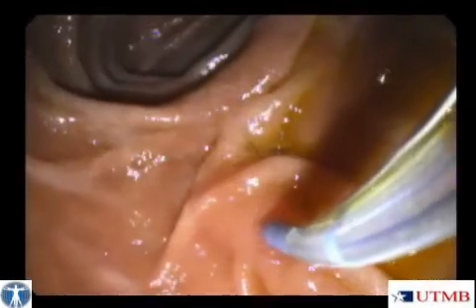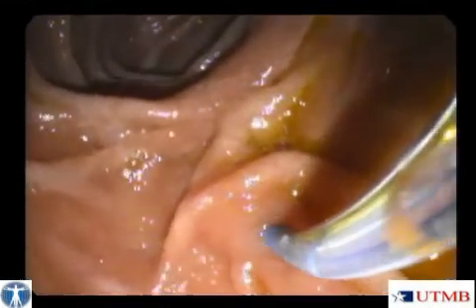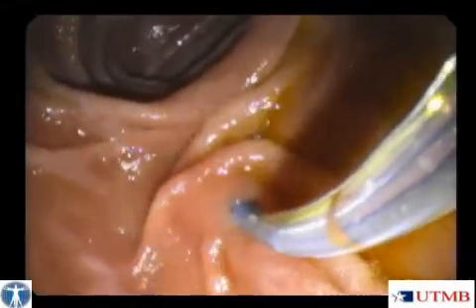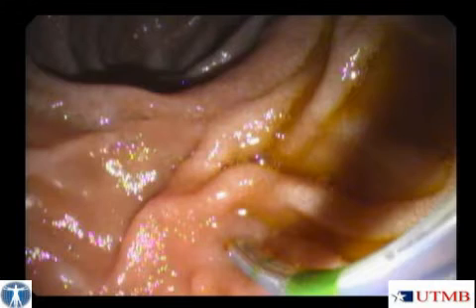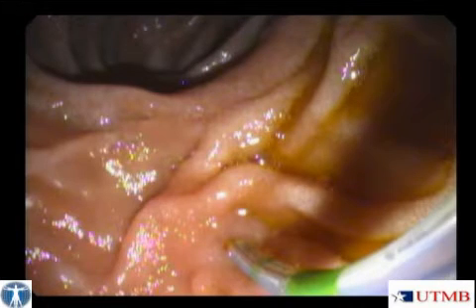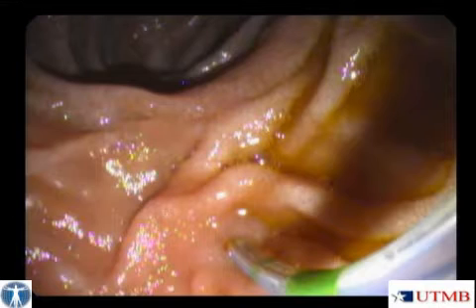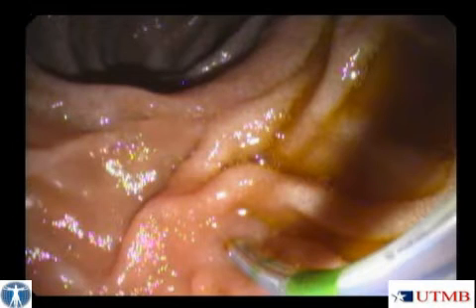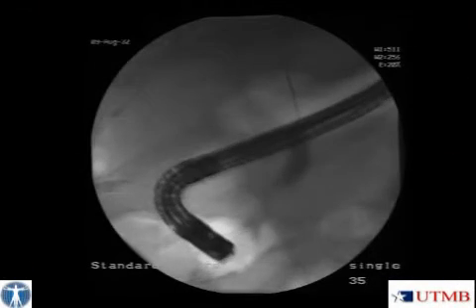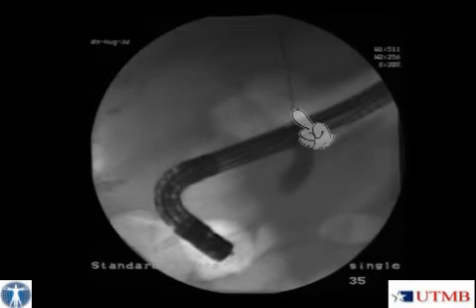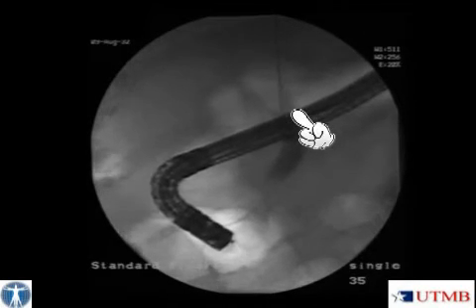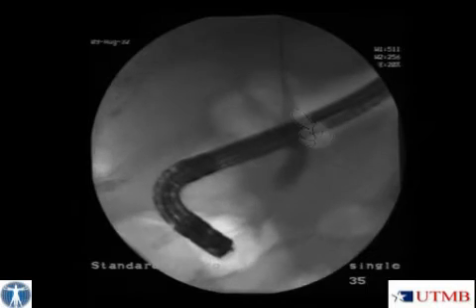This patient presented with obstructive jaundice secondary to choledocholithiasis. We began by performing endoscopic retrograde cholangiopancreatography, or ERCP, under conscious sedation. We used a wire-guided sphincterotomy to cannulate the ampulla. A cholangiogram was obtained. Here you can see a dilated common bile duct and a 12 mm common bile duct stone.